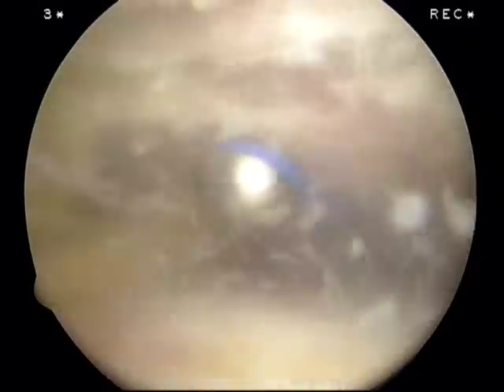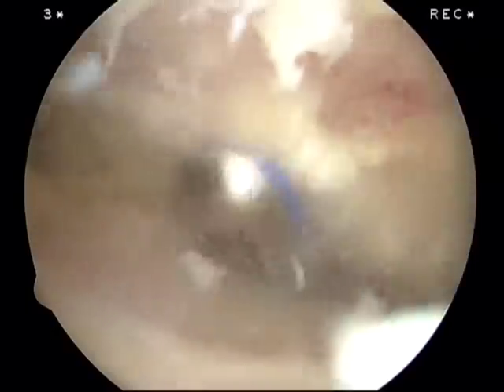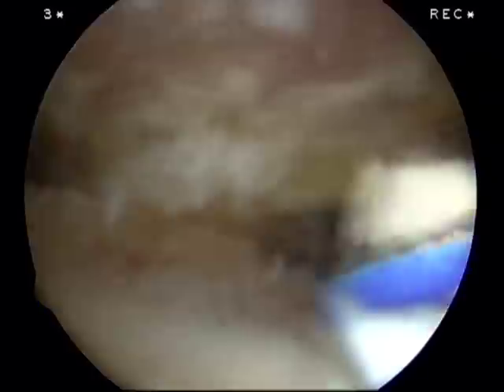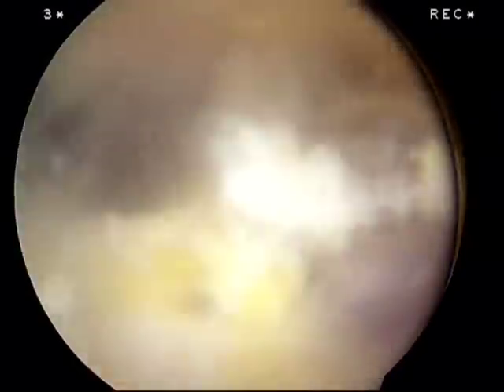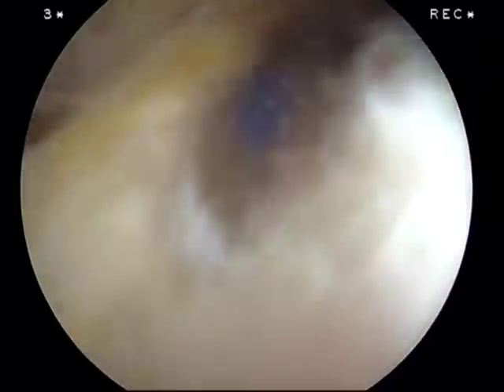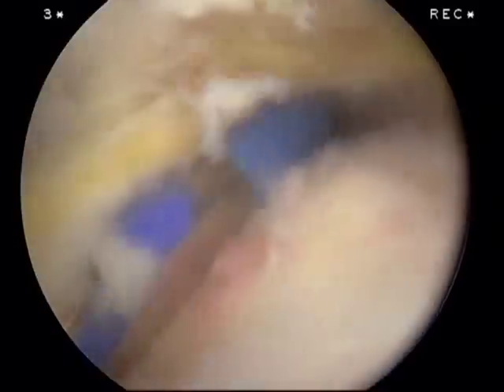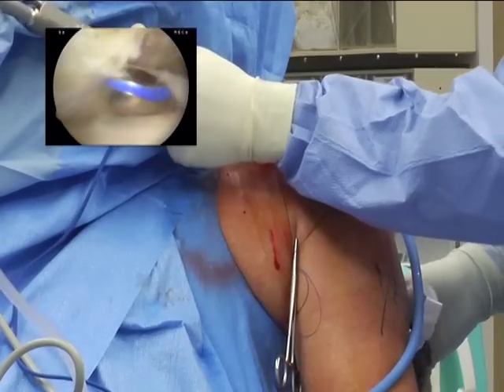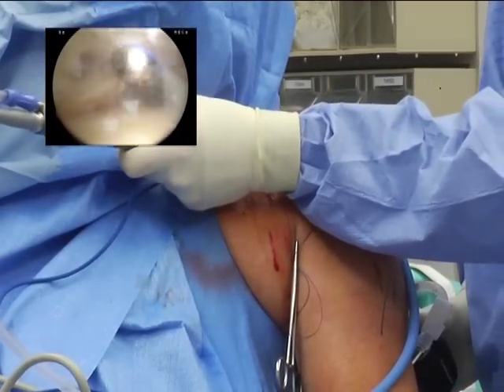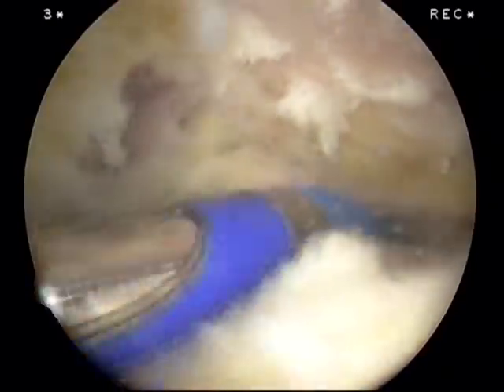The more I go, the less tissue you see floating around in here. As we work to the very front of the acromion, that's when we're going to meet the coracoacromial ligament. It's very easy at this point just to resect it off the acromion, but I typically leave it — it's a landmark. By leaving it, I feel you have less soft tissue extravasation of fluid. If you have bands you want to break, just pinch them up underneath the acromion, run in one direction, and cauterize — that'll typically just cut them.